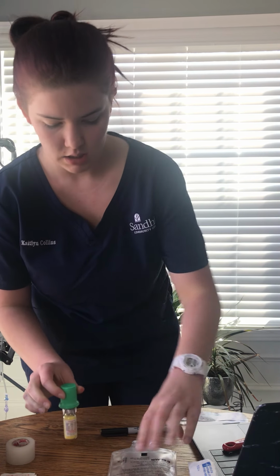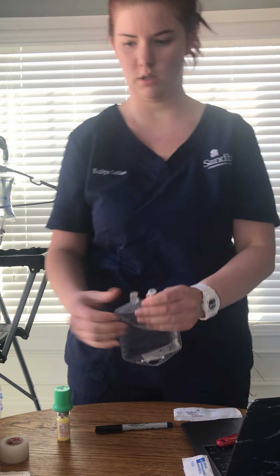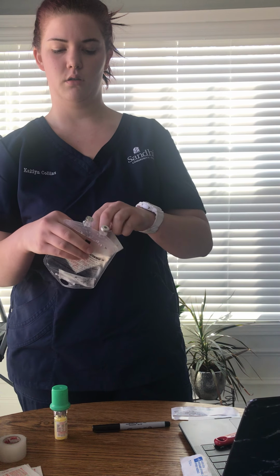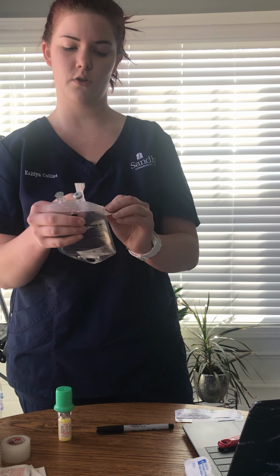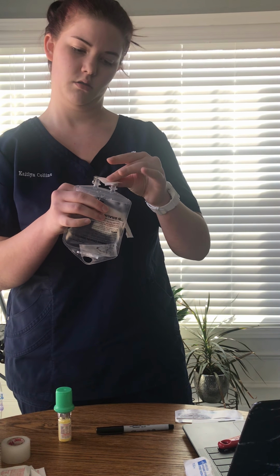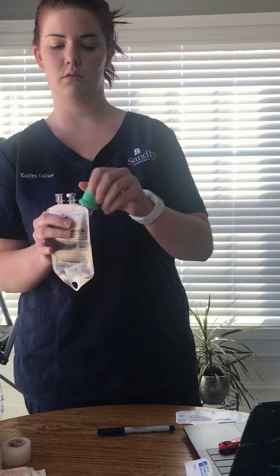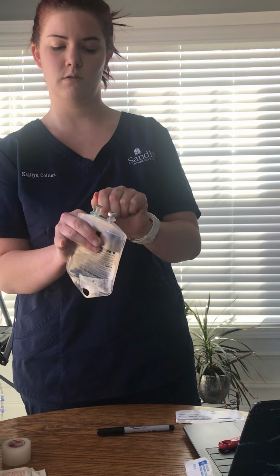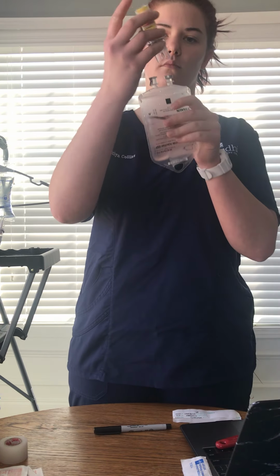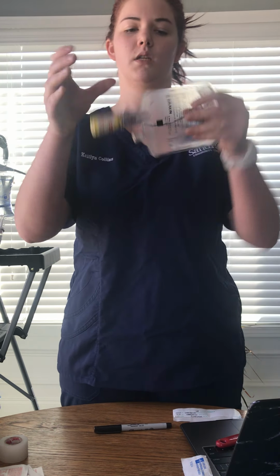And now I pop this, and that goes in the trash. And alcohol swab this, 30 seconds. And trash, and I let it dry. And then I'm going to attach this end and begin mixing.